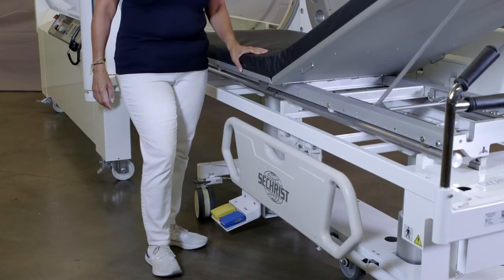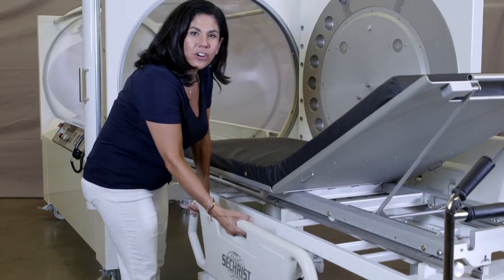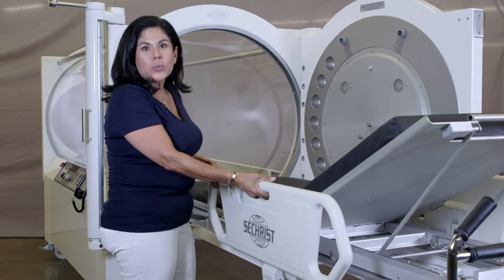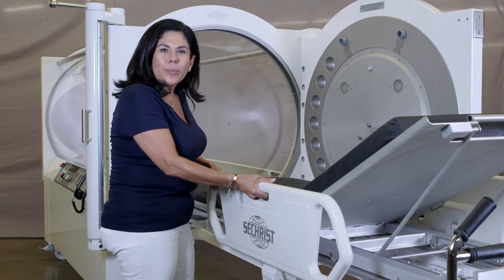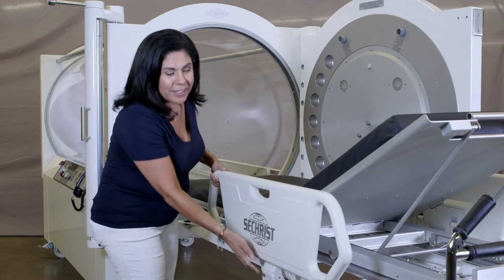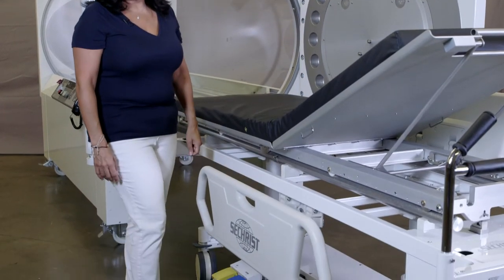The Sechrist eGurney wheeled stretcher has two patient side rails. To raise them, firmly lift and snap into place. As always with any gurney, make sure that it's firmly in place for patient safety. In order to lower it, simply lift the latch and it'll ease down on its own.